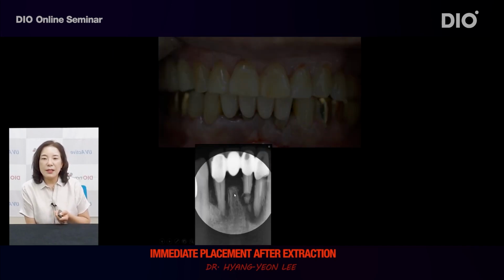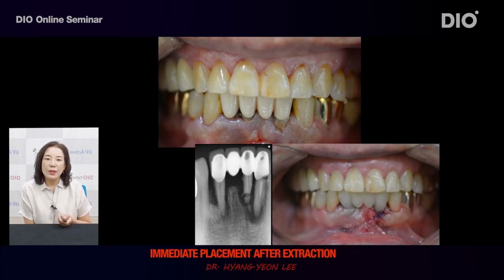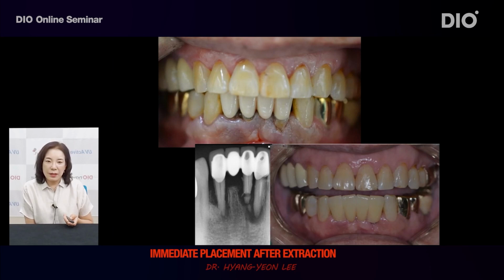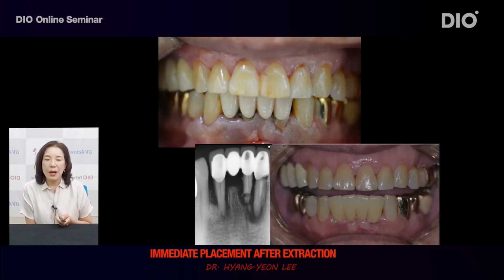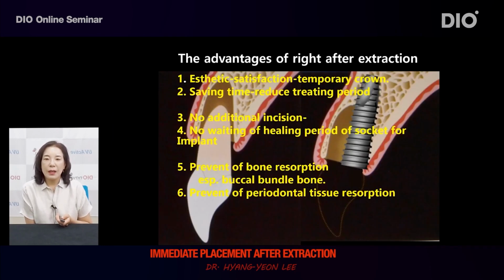In the case of this patient, it is inevitable that the periodontal tissues will shrink in accordance with the direction of the bone absorption when tooth is extracted due to severe inflammation. It is possible to prevent absorption of periodontal tissues that assists bone with inflammation by placing implants immediately after extraction. This is the photo of completed procedure. You can see here that there is no major difference in the periodontal tissues prior to and after the tooth extraction. If implant is placed immediately after the extraction, it is also possible to prevent absorption of periodontal tissues.